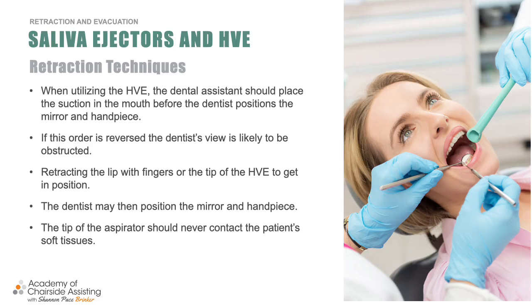And again, let's start now with the second area, which is the high volume. And this is going to be our best friend. This is what we utilize 99% of the day, is utilizing the high volume suction.